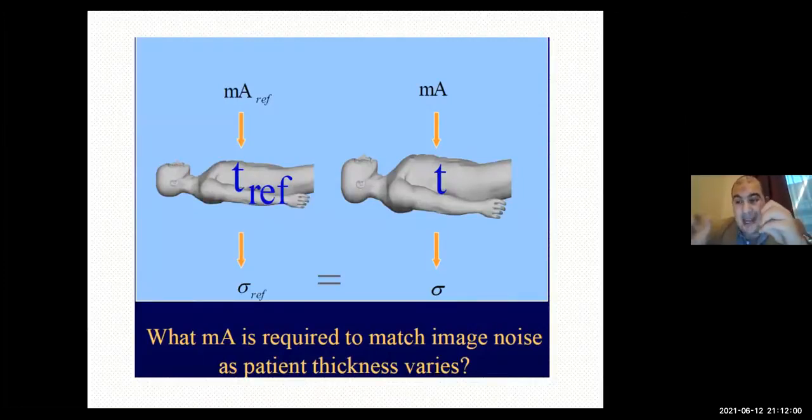What is the milliampere I have to use for this patient? If I have an obese patient, I have to increase the milliampere. If I have a small patient, a moderate sized patient, or a baby or child, I have to reduce the milliampere.